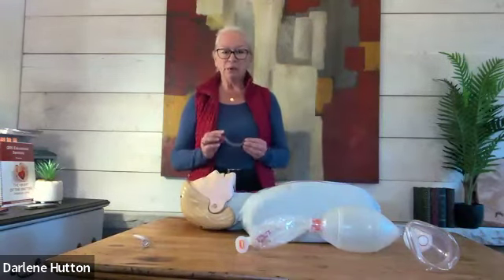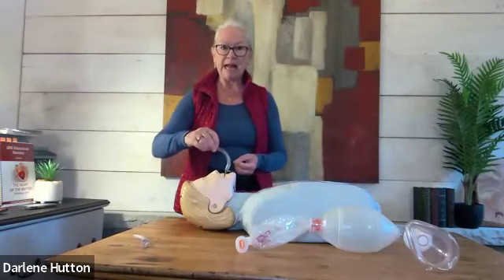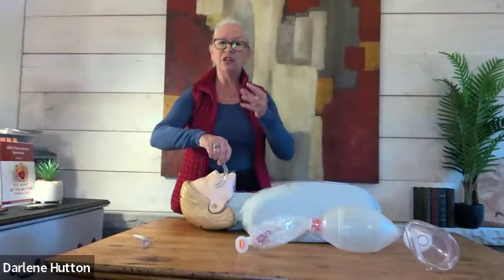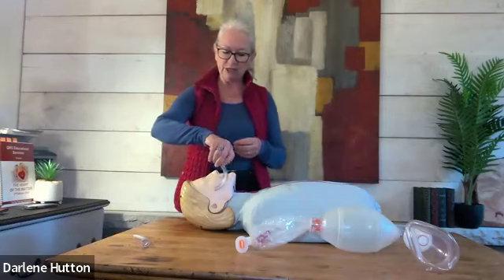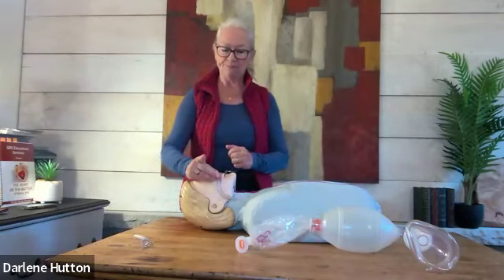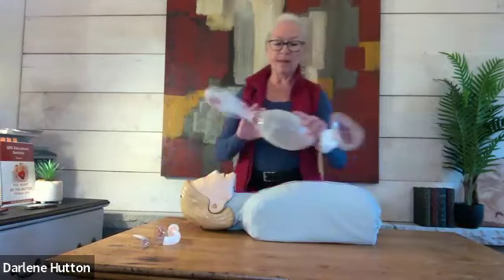Let's go back to the oral airway. When we insert the oral airway, it is going to start off by going upside down into the mouth. And when you get to the junction of approximately the hard palate and the soft palate, you're going to rotate it and continue inserting it down. Now that we have our oral airway in, we're ready to bag our patient.